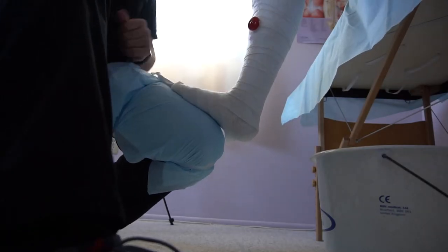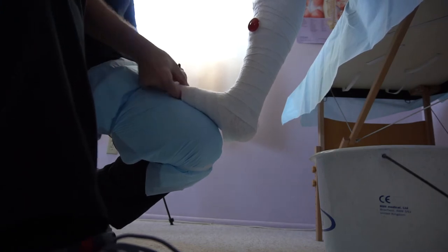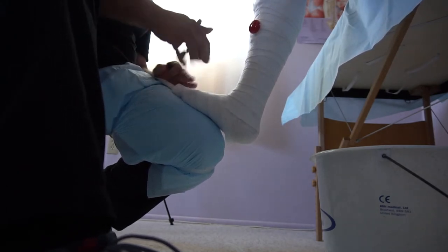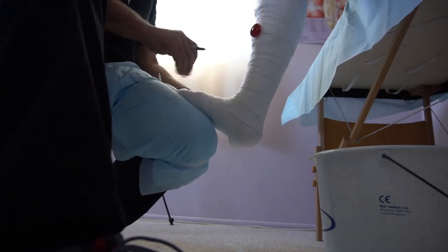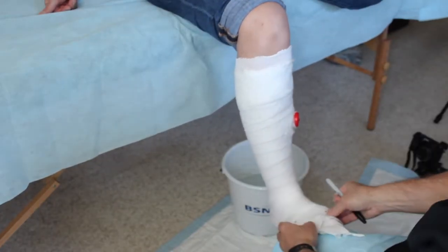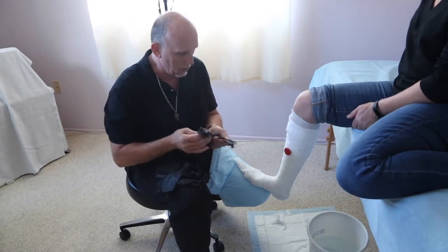Now, that trick we spoke of with finding the metatarsal heads. Where the toe begins and the metatarsal ends, you'll feel a little divot right there — and that's where you want your fiberglass to end, so we're going to mark it right on top. Find the small toe where the phalange begins, go right on top and put a dot there. And that is the angle we're going to want our fiberglass to be at. Instead of trying to guess it, all you've got to do is connect the dots.